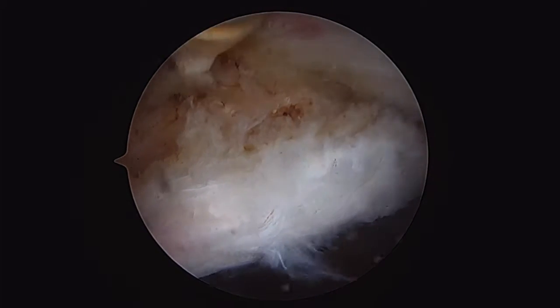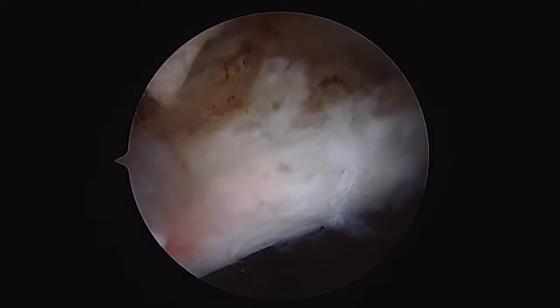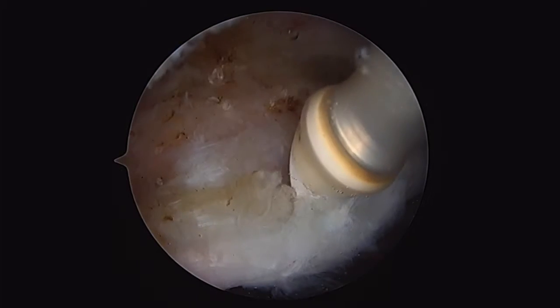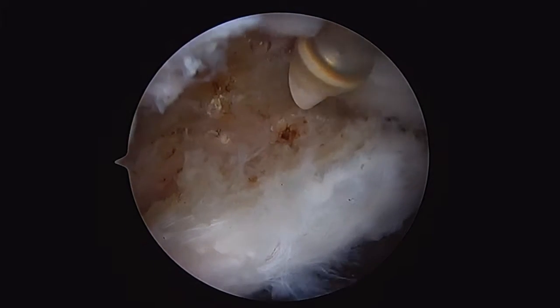This patient has a pincer lesion. I'm elevating the capsule and dissecting carefully, preserving as much tissue as possible for my capsule closure later. I'm also going to liberate the labrum up off of the pincer lesion.